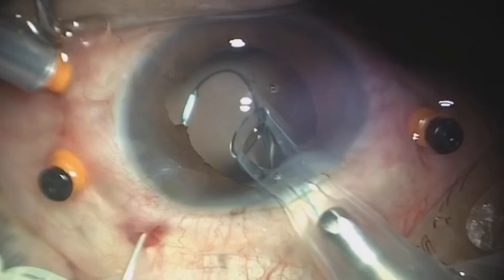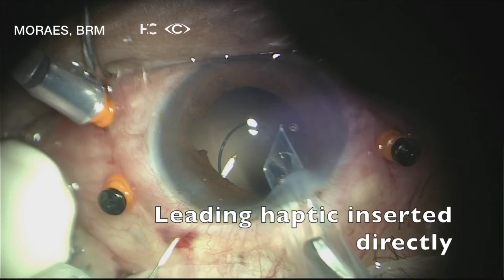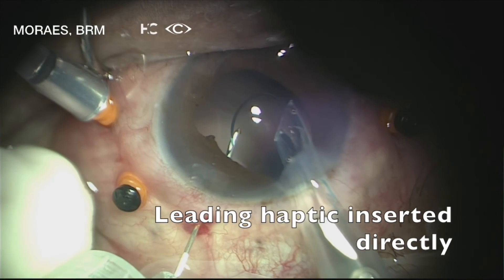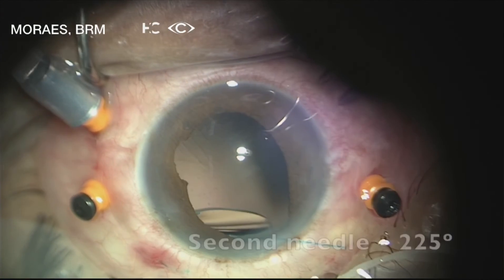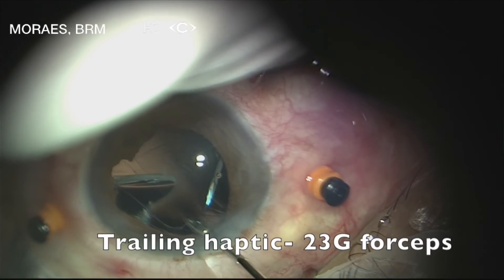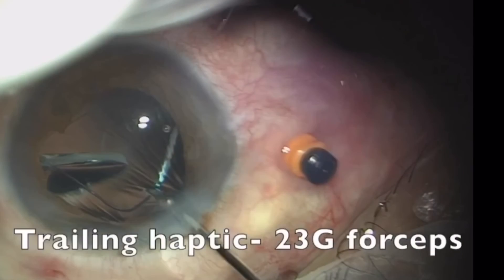The second tip is to insert the first haptic directly into the needle lumen. Using this suggested position, surgeons are able to use the left hand to hold the needle and the right hand to manage the haptic inside the anterior chamber. Here the surgeon uses a bipolar cautery for flange creation. The second needle was inserted at the 225 degree position and with retinal forceps the second haptic was inserted into the needle.